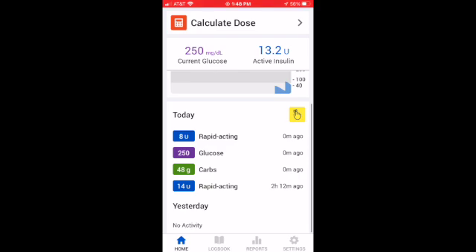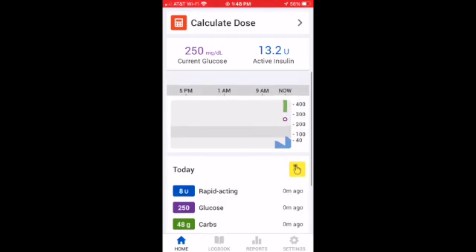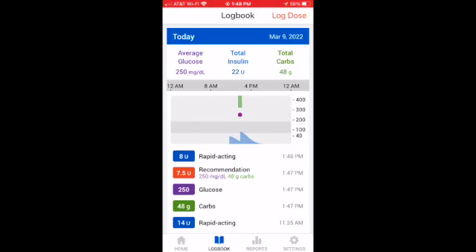That way there's never a question about, did I take that dose at lunch? It's right there in your app.